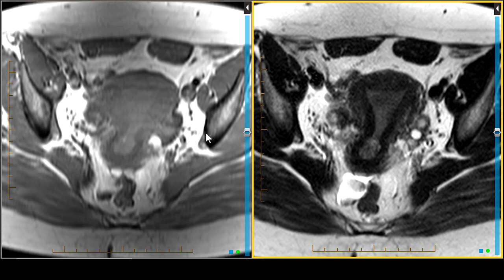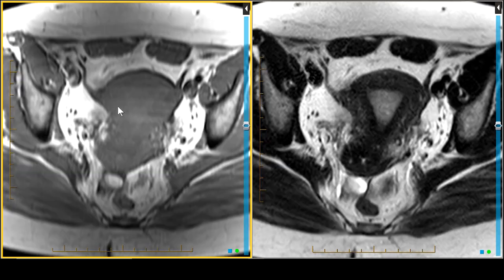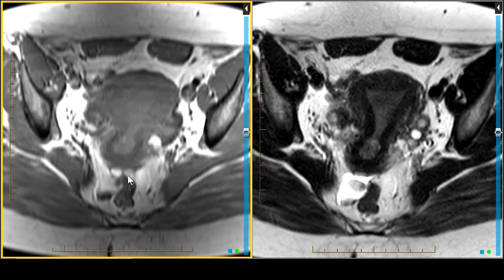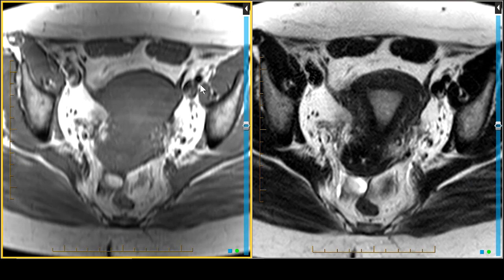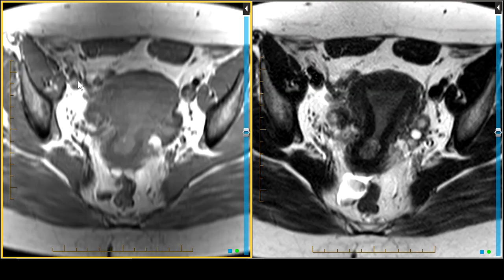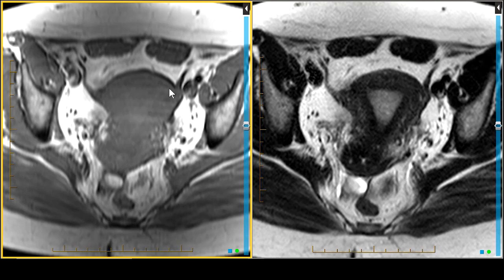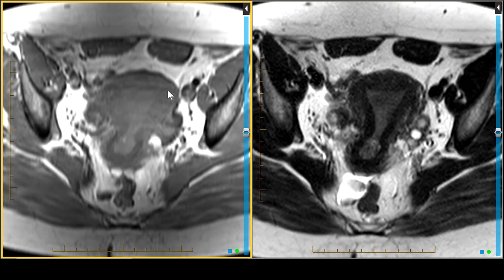Here's the axial orthogonal T1 and a paired axial orthogonal T2 as a reference. The T1 being fat-weighted, you see an excellent fat-uterine interface — you see the sidewall of the uterus, the sidewall of the pelvis; any infiltration there would be easy to discern. You'll also use the T1 as an anatomy image to look for lymph nodes, you might use it to look for deep vein thrombosis. Here are the round ligaments of the uterus, by the way.